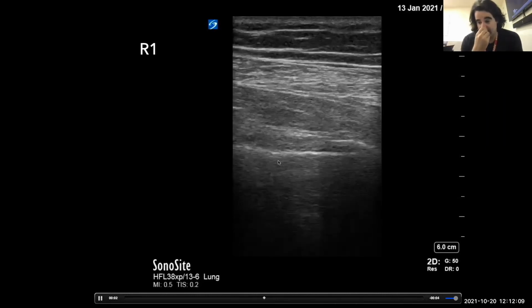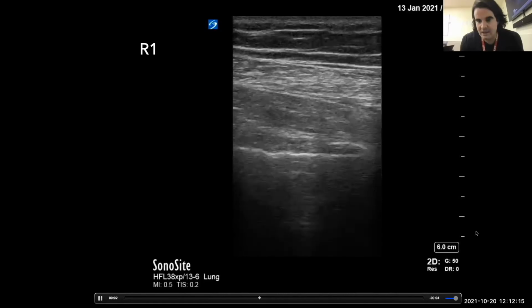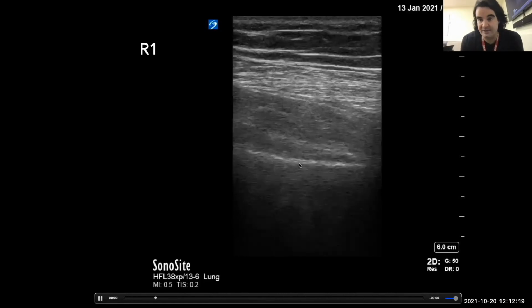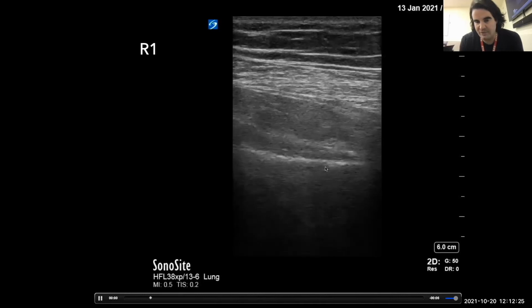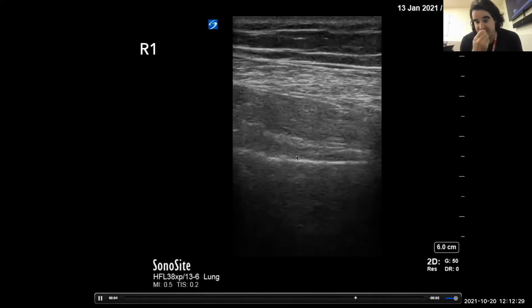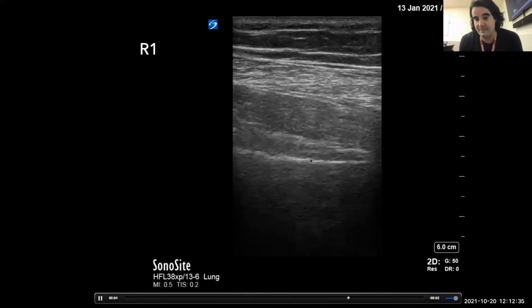This is where the visceral and parietal pleura have immediate apposition. And we don't see full sliding here, but we do see some suggestion that there is pleural apposition, albeit it's quite a weak slide. But nonetheless, I doubt there's a pneumothorax here, recognizing that this view is maybe not optimal. Okay, so usually 10 centimeters. The linear probe does help clarify pleural findings, but it's not the best for depth.